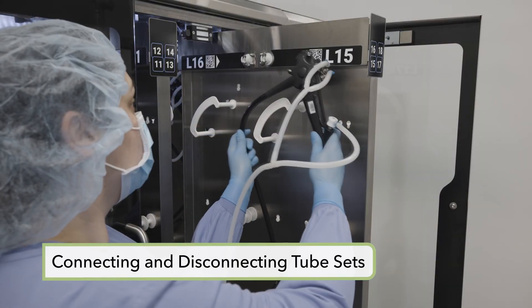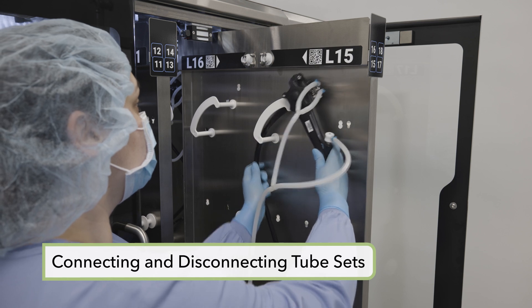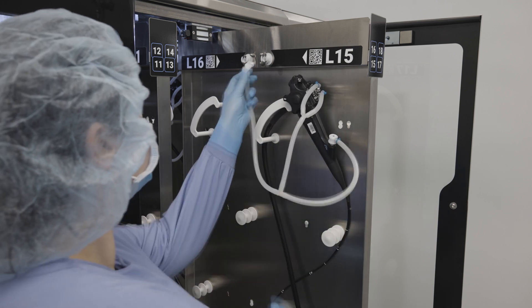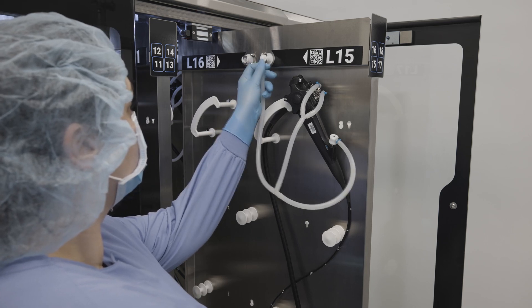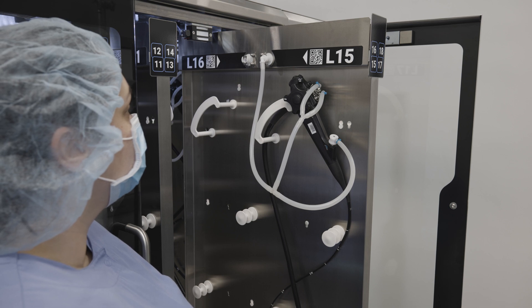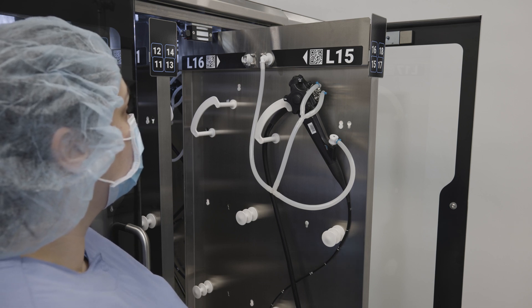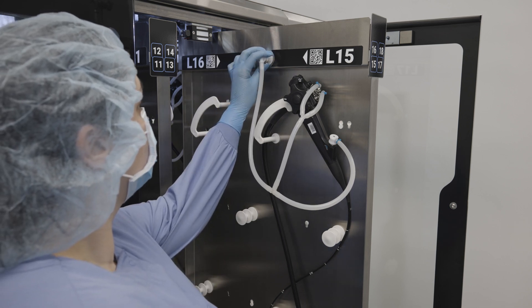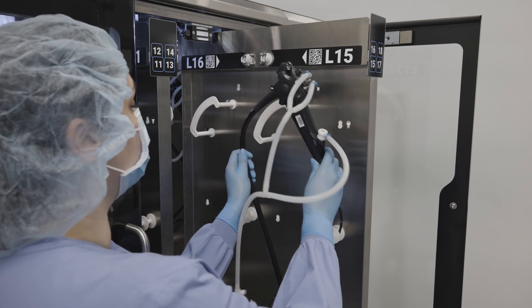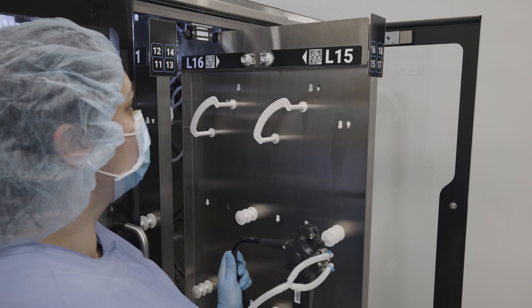To connect the tube set, first attach it to the relevant endoscope ports and connectors, then place the endoscope on its hanger. Second, plug the tube set into the cabinet purging system manifold on the storage panel; a click will be heard indicating a correct connection. To disconnect the tube set, press the metal tab on the manifold connector to release it, then remove the endoscope from the cabinet and then the tube set.